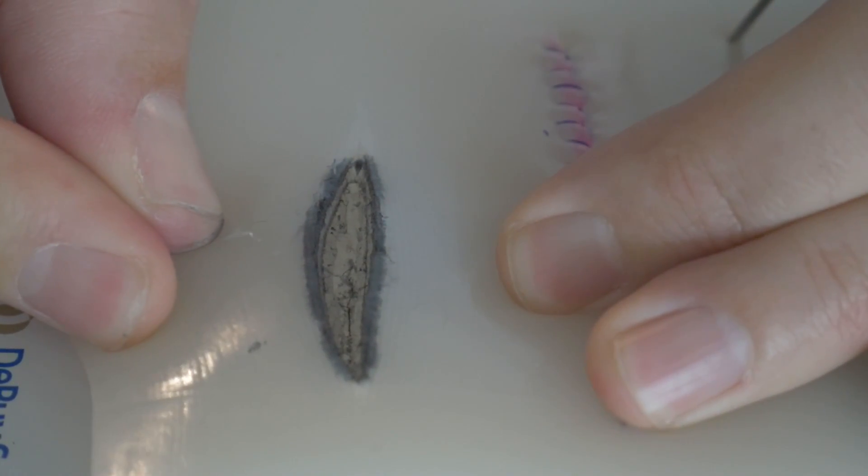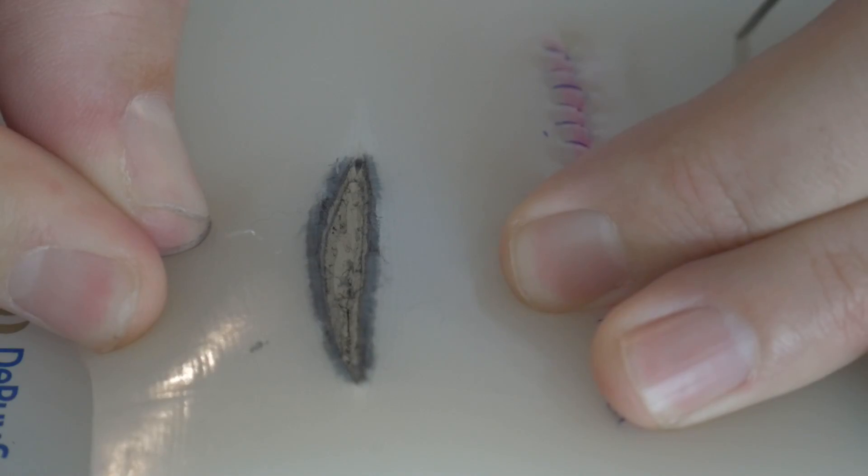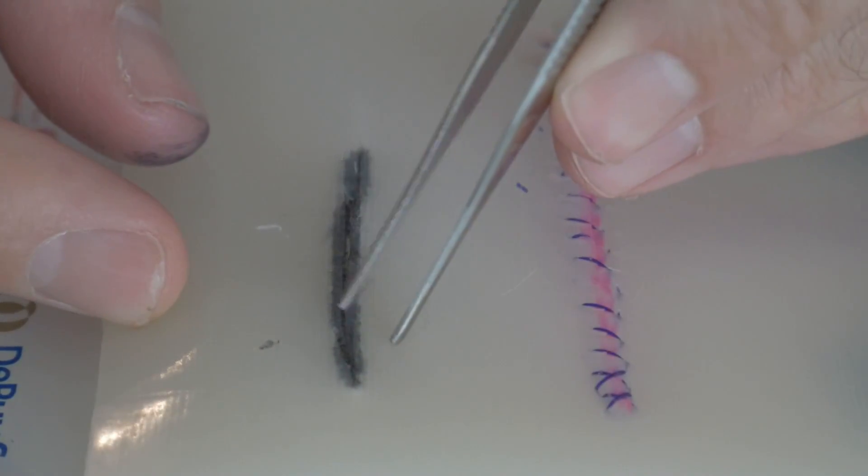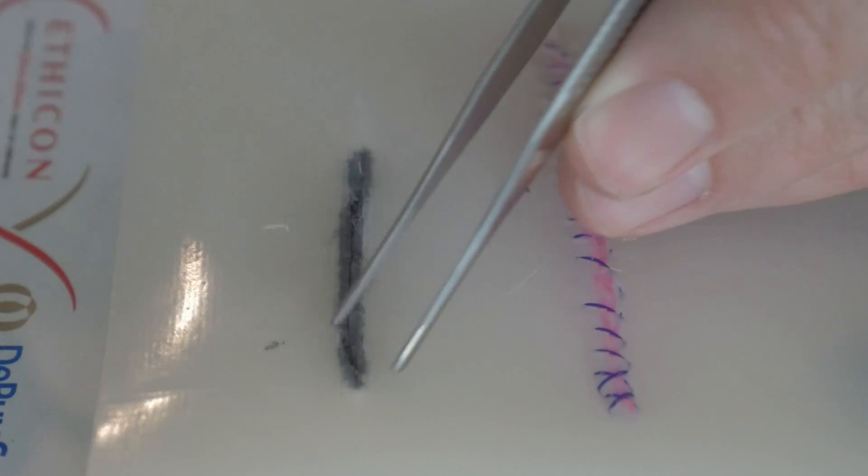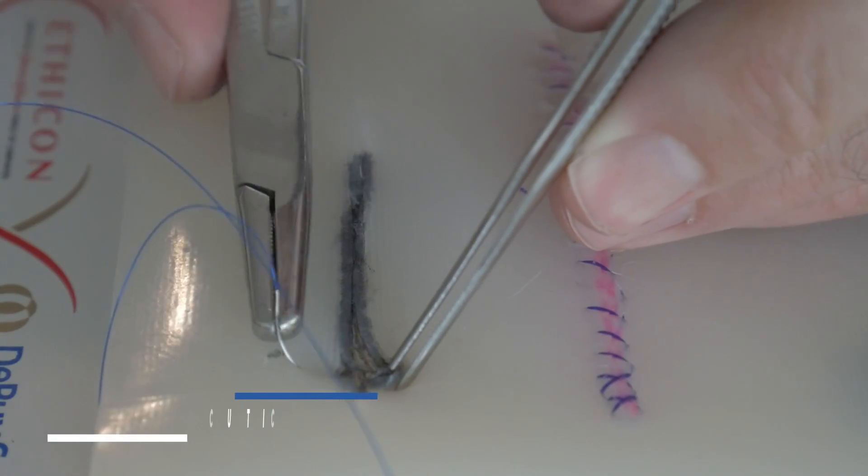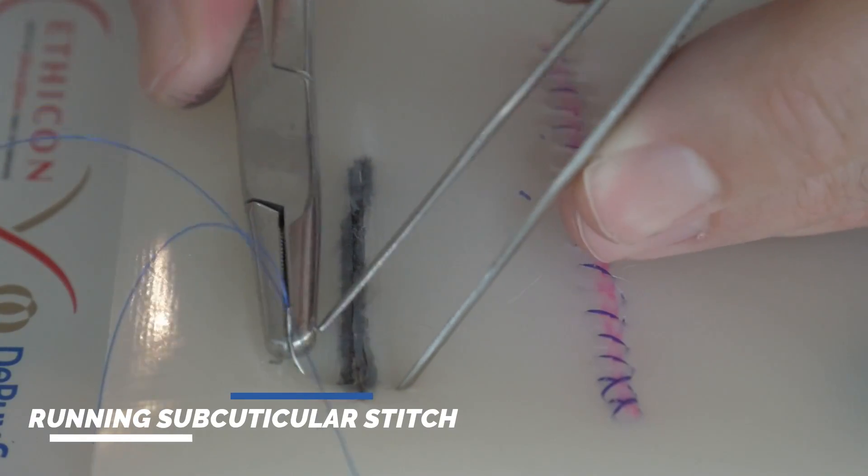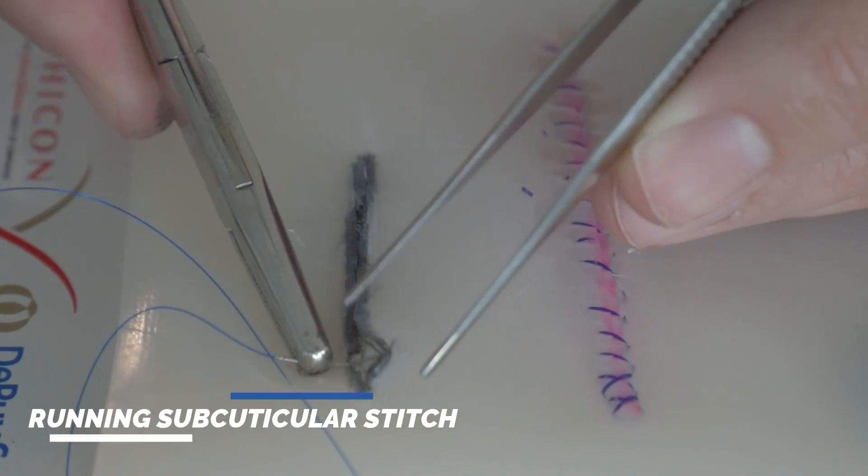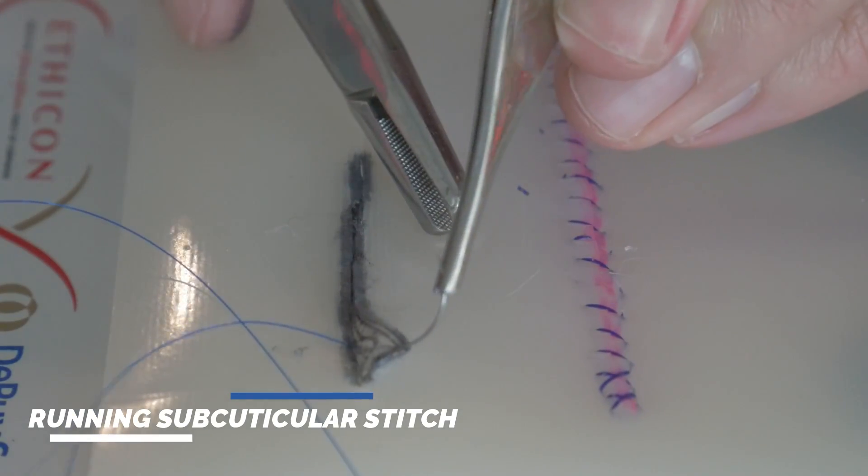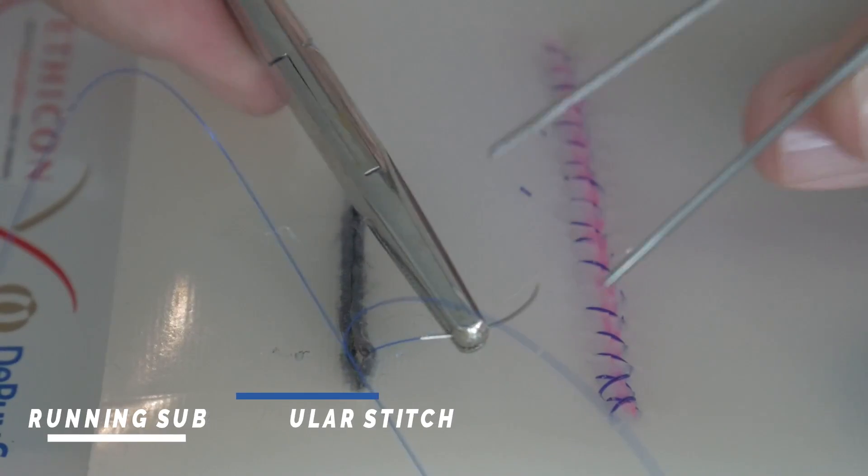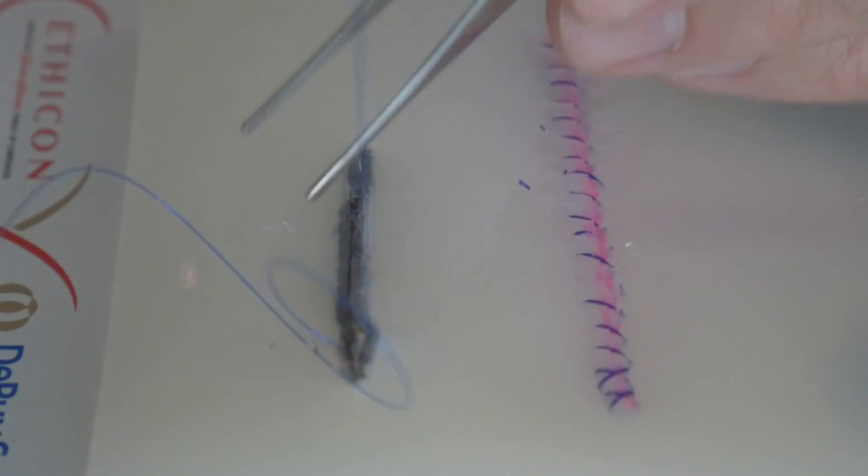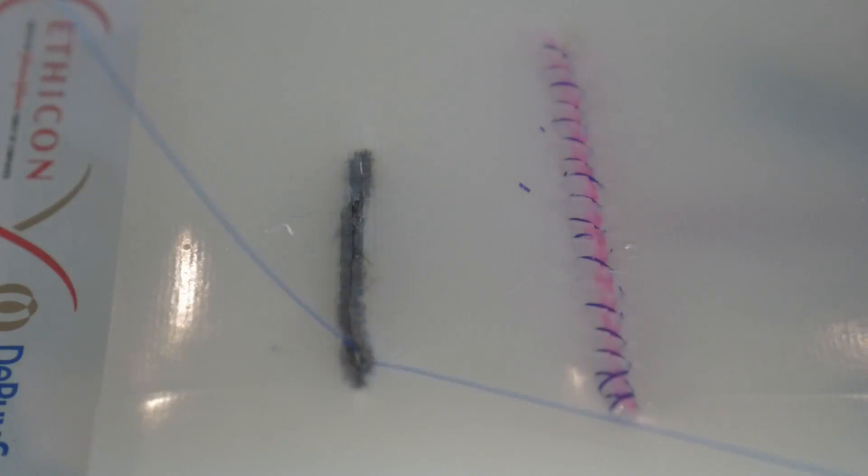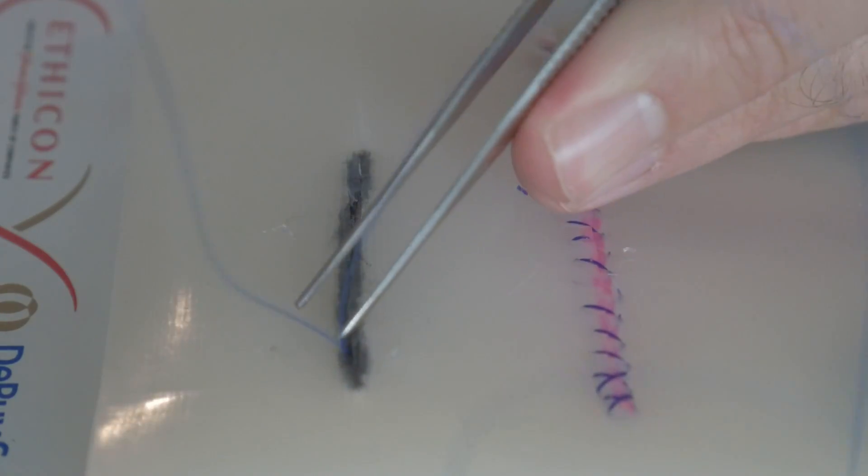All right, so I have some fake skin set up here, kind of cut it. It was really hard to cut and I tried to color it in with some Sharpie so you can actually see it. We're going to be doing a running subcuticular stitch. As you can see, this first bite I'm taking is deep to superficial. And then on the other side of the incision, once I get it through here, is going to be superficial to deep.